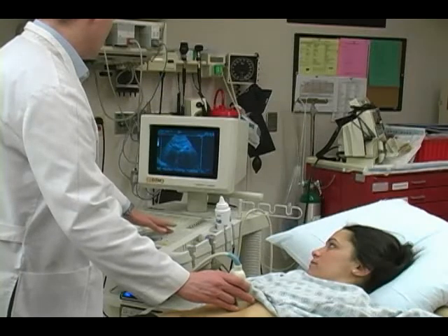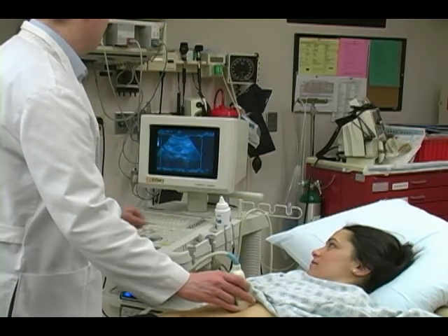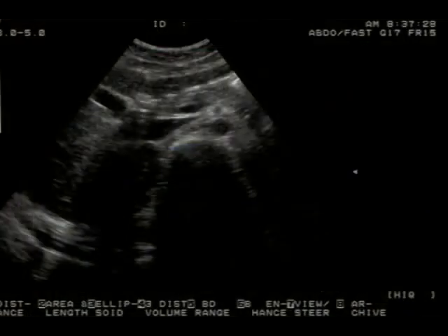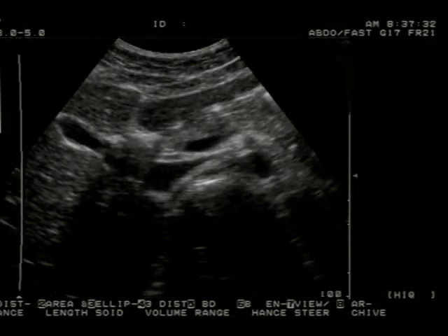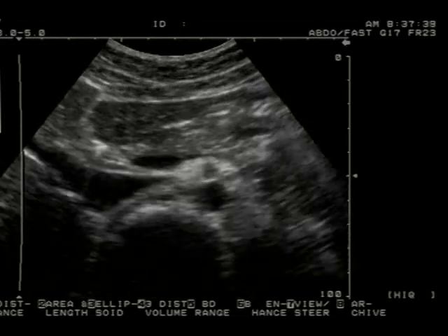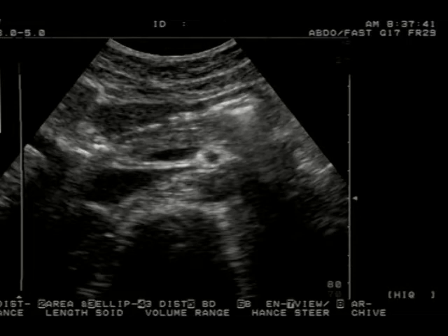Ultrasound machines will allow for adjustment of the tissue depth being interrogated. Depth is usually adjusted by pressing key depth buttons. By adjusting these buttons, the depth interrogated may be increased or decreased as desired. When scanning an area of interest, the target area should be centered on the ultrasound monitor screen, both by adjusting probe position and adjusting the depth.